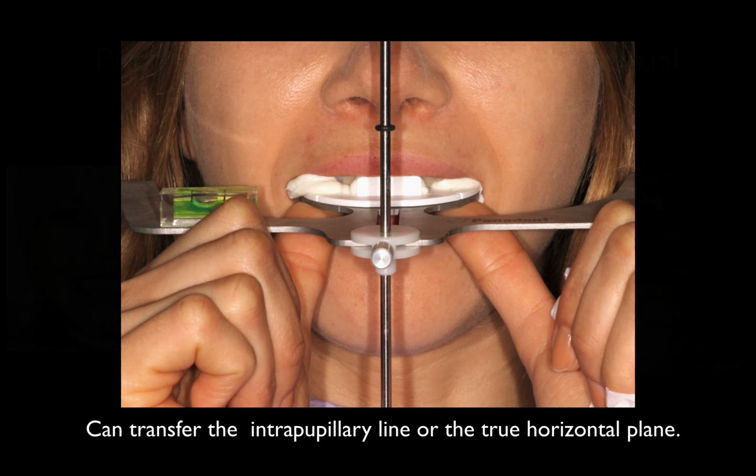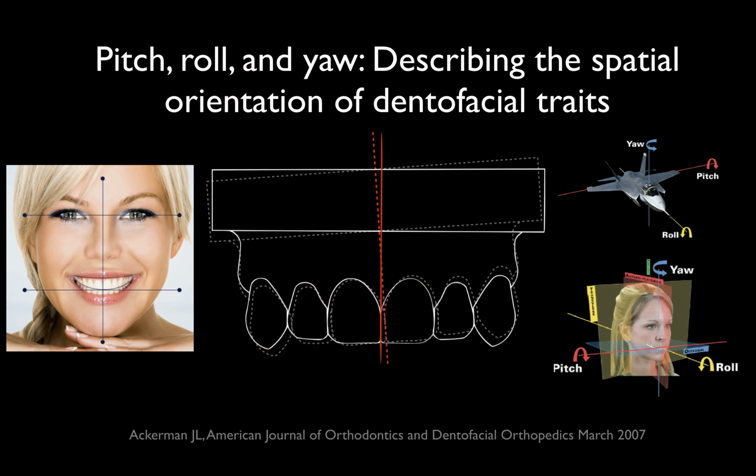And why do we want to do this? Well, the reason is because to get proper facial and dental aesthetics, we need to be aware and communicate to our technicians the pitch, yaw, and roll. And by using a facebow mounting, we are mounting our aesthetic plane to that of the top of the instrument. So the technician knows that the top of the instrument is our aesthetic plane. They will also drop a perpendicular from the top of the instrument, and that will make the midline. If you mount incorrectly, you're going to end up with a midline cant, and that's going to be unesthetic, and you'll have a failure on your hands.